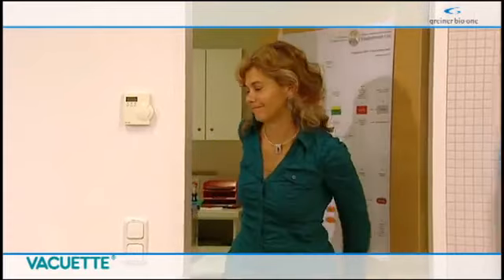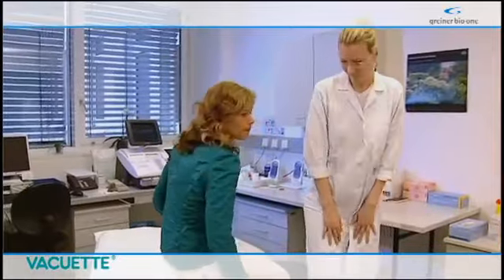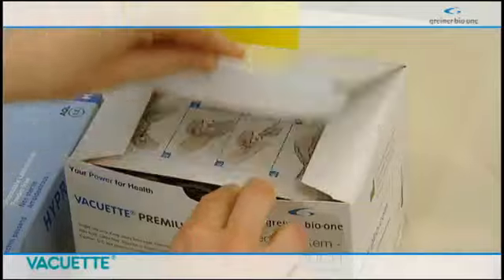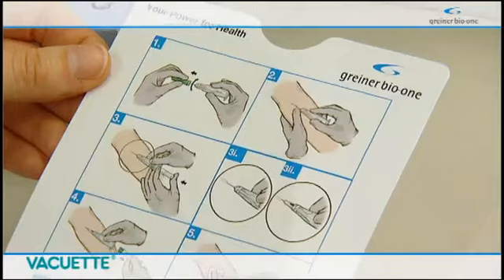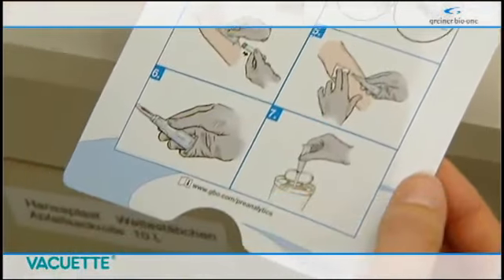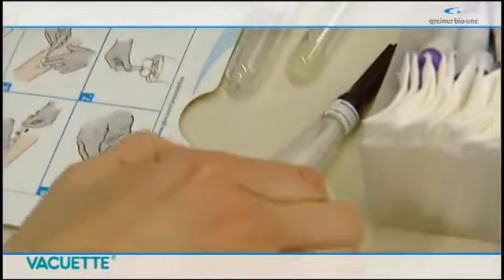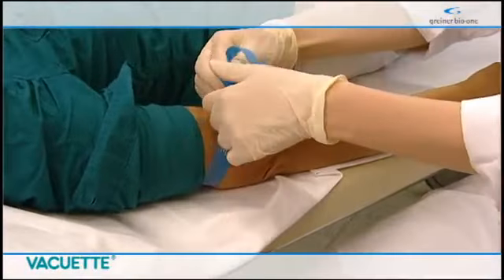The new Vacuette Premium Safety Needle System from Greiner Bio-One protects the user against needle stick injuries during blood collection reliably via the automatic functioning, reducing the risk of infection to an absolute minimum. The handling couldn't be easier.